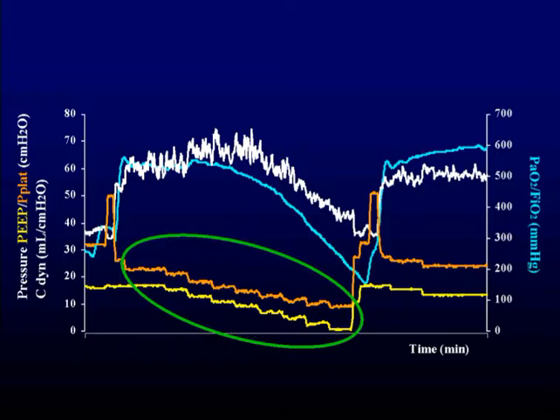And we were looking for the closing pressure point. And this point was defined in two ways. According to oxygenation, which meant a decrease of 10% of the maximum oxygenation obtained after recruitment, and with compliance, it was the reduction of compliance after reaching a maximum value after recruitment.